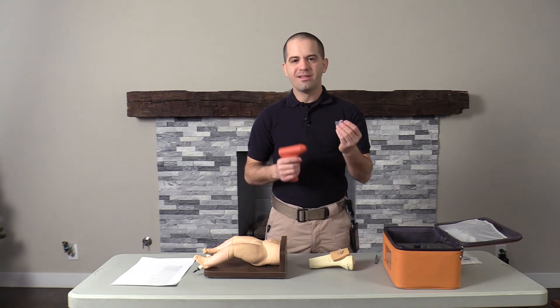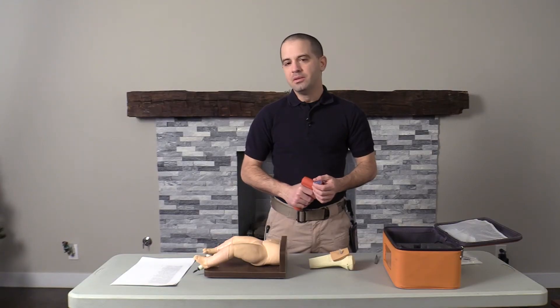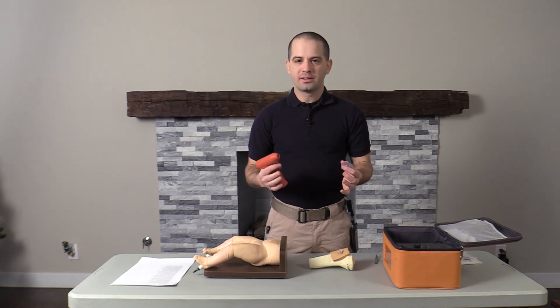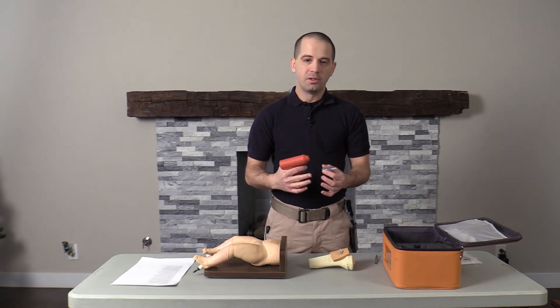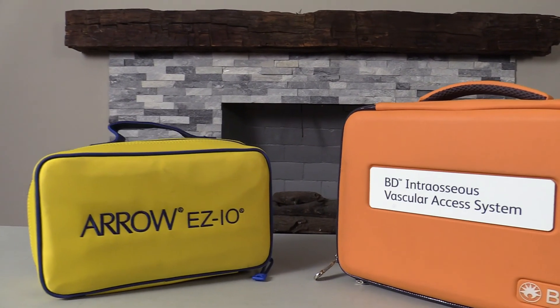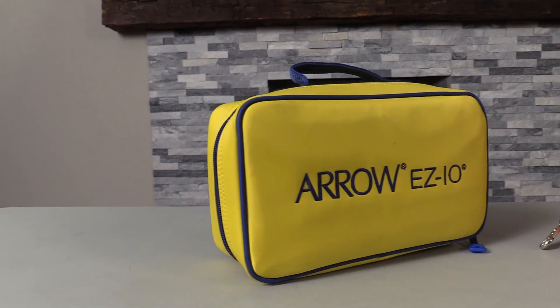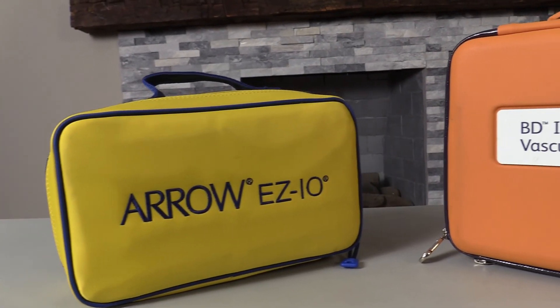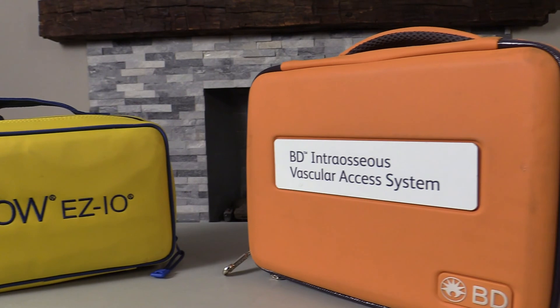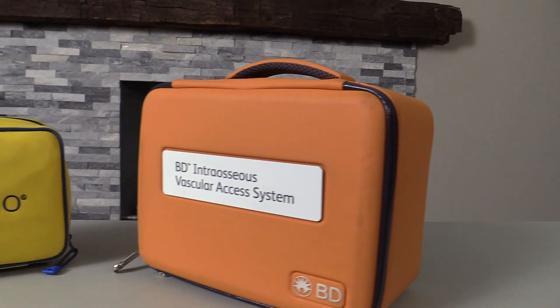Third, EZ I.O. needles are not compatible with this device. That's one thing I like about the SAM system — you're able to cross devices and needles between SAM and EZ I.O. And lastly, a really minor issue: I do feel the case that it comes with is very bulky compared to the EZ I.O. case. This can make it much more difficult to fit into a jump bag, and I foresee this case actually sitting on the shelf of an ambulance or on a crash cart.